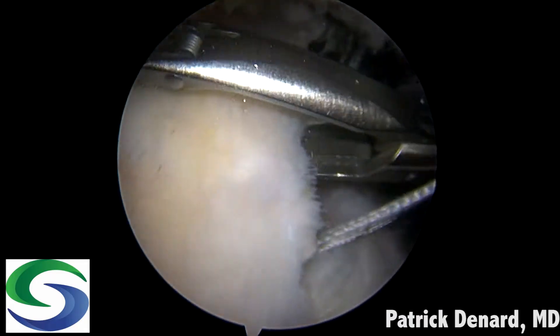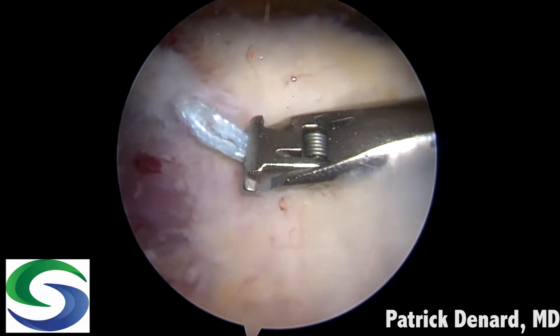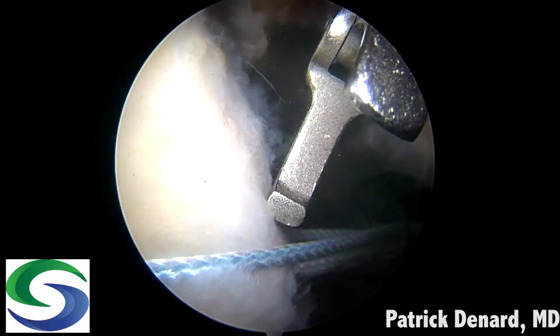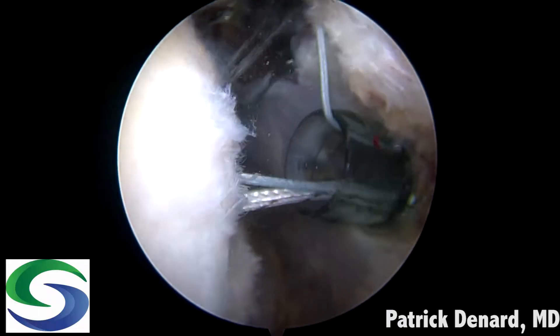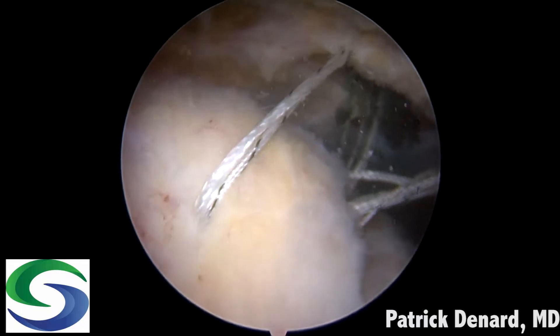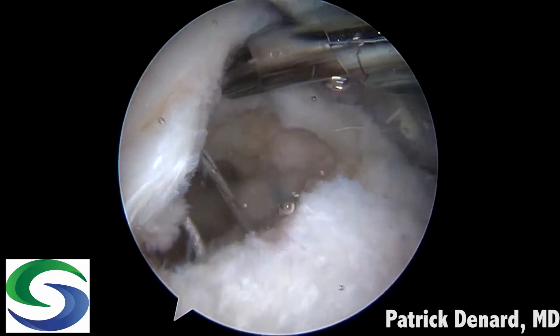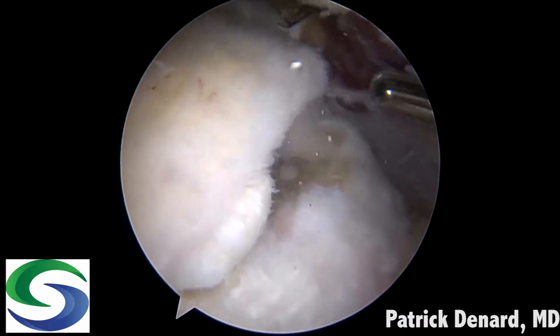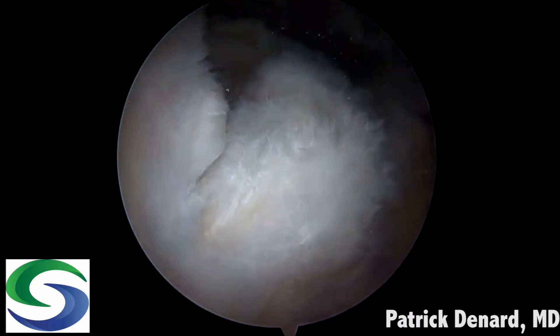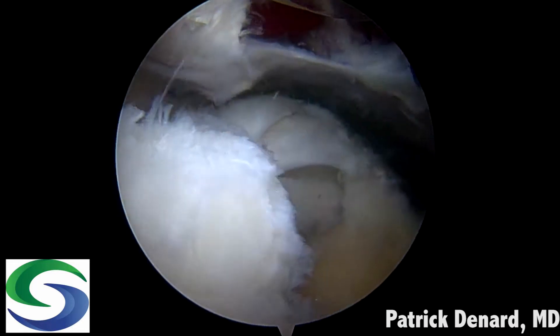Here we see those 2.6 millimeter knotless anchors impacted in place. We go to the subacromial space and retrieve the posterior sutures at a lateral portal. A fiber link suture is passed through the rotator cuff — it has a loop on one end so I can shuttle all sutures through the rotator cuff from the posterior medial anchor. The process is repeated anteriorly, so both sets of suture limbs are passed through the rotator cuff from the anterior and posterior anchors.